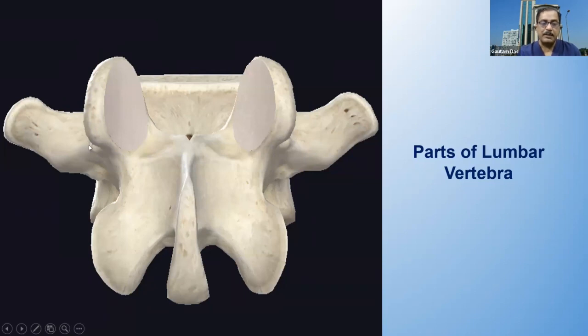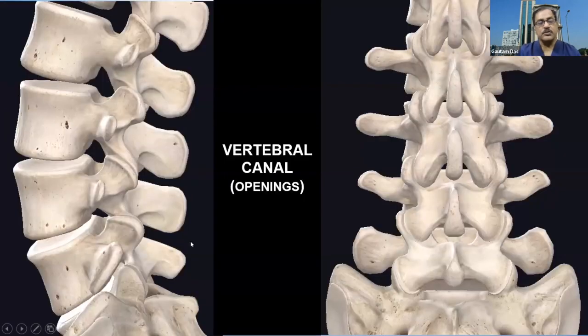And there is a ligament. I'll be coming to that mammillo-accessory ligament under which the medial branch actually runs, and the other parts: lamina, inferior articular process, spinous process. You all know that. If you are looking from the lateral view, then the vertebral body, the transverse process you can see it's small. This whole is your superior articular process. This projection is your mammillary process.